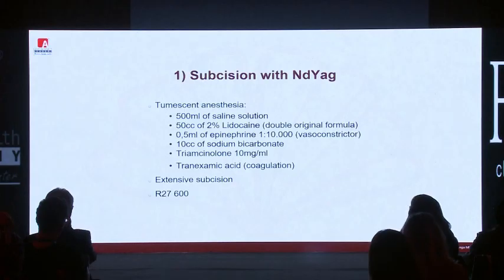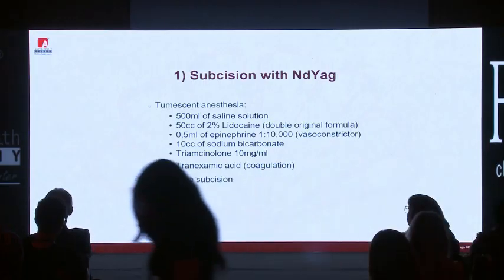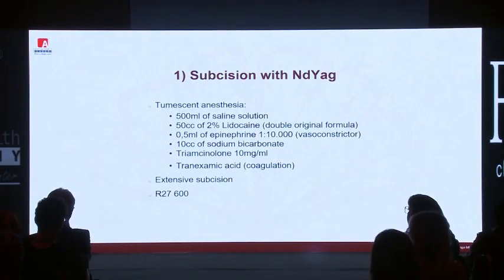I did a very extensive subcision because you can see the important scar and the fibrotic reaction of the skin.